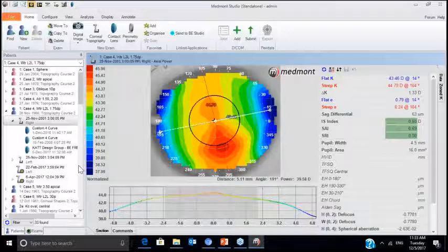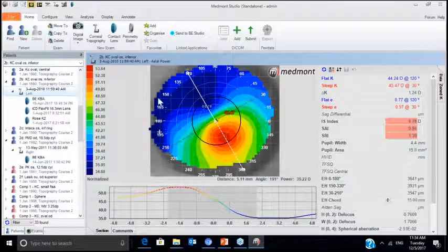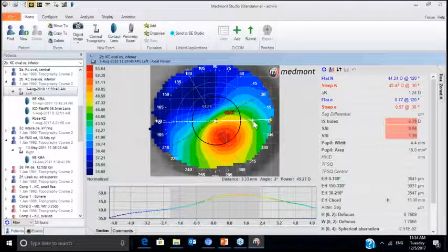So here's our contact lens with our landing at 3 and 9 o'clock, just like we predicted. However, in the vertical meridian, you can see the amount of fluid underneath the alignment zone here and here. So clearly, this patient needs a toric alignment of the periphery to best fit this cornea. This patient has limbus to limbus corneal astigmatism.